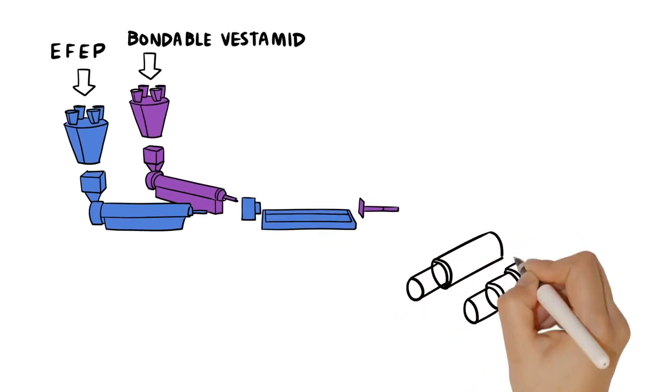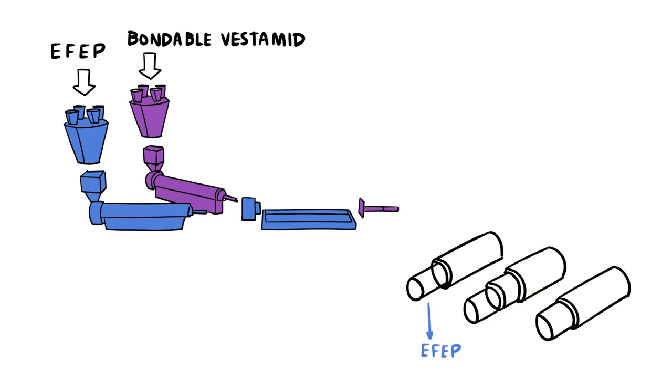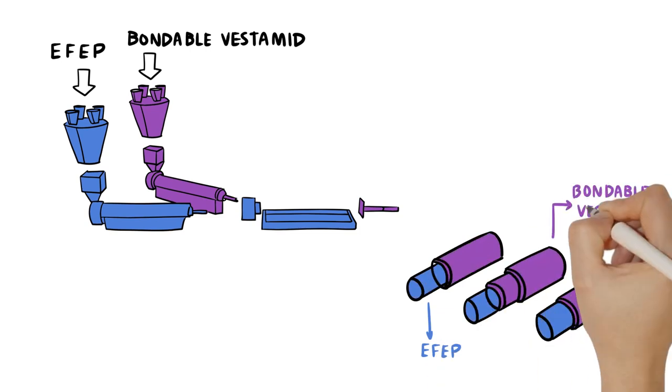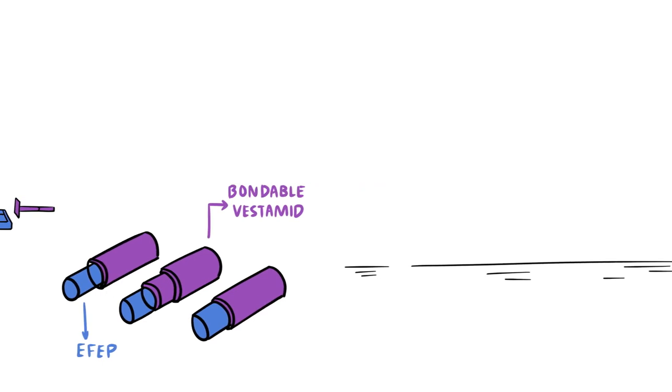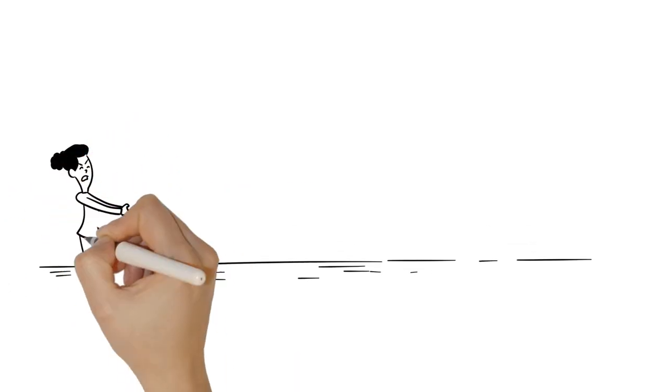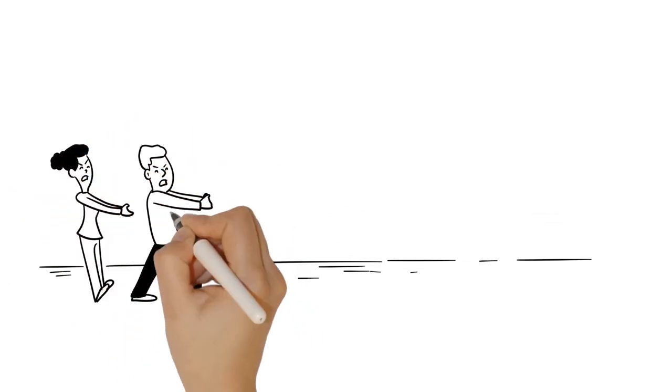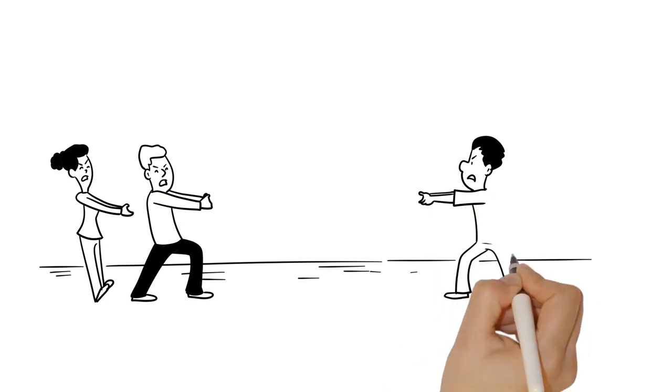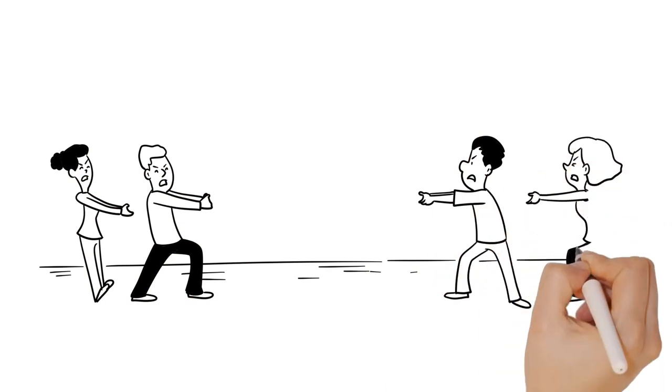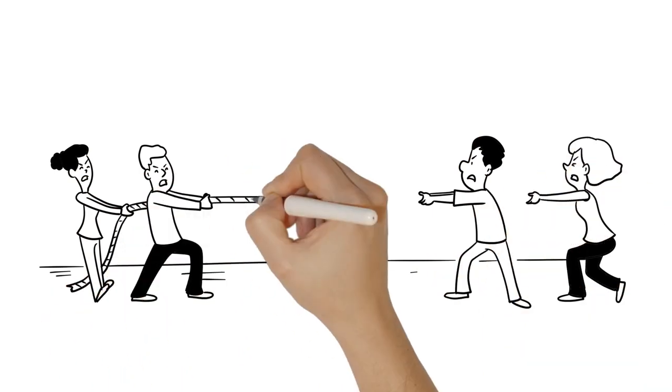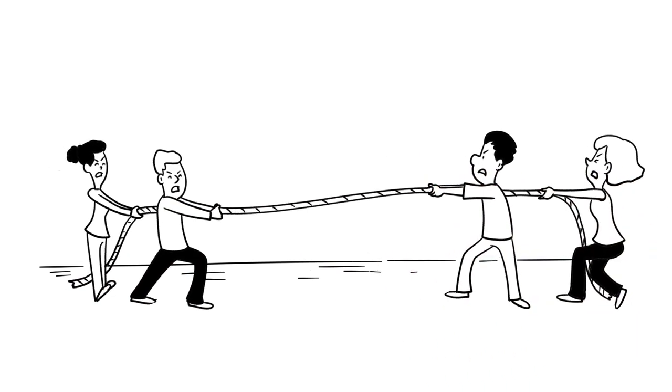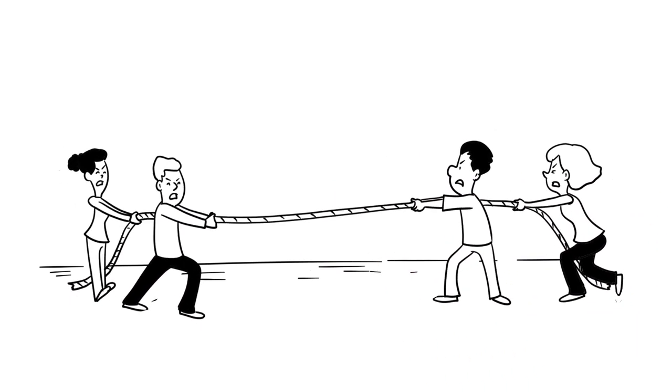Both polymers travel through full length of extruder and exit the die as a well-bonded, two-layer catheter, all in one step. The unique chemistry of bondable Vestamid allows it to adhere with fluoropolymer exceptionally well, without need of surface treatment or adhesive layers, to produce a catheter that can offer up to 10 times more bonding peel strength than current products.